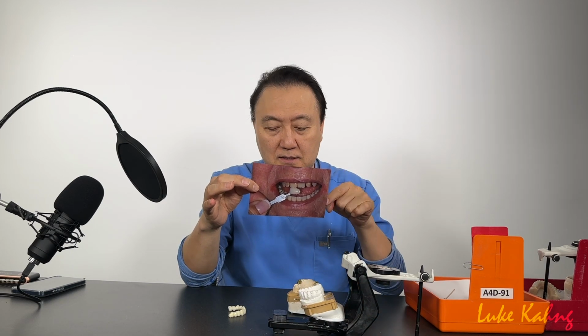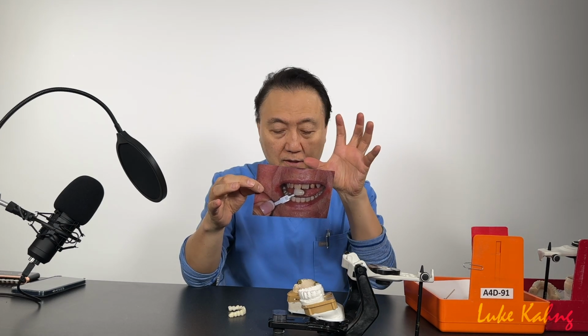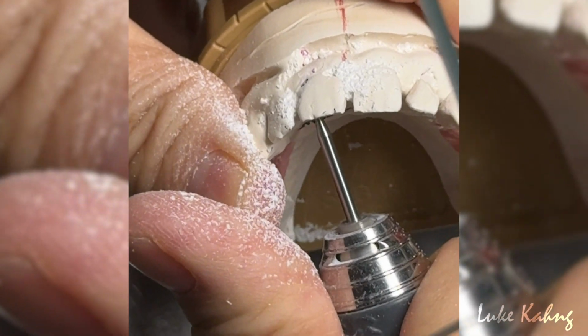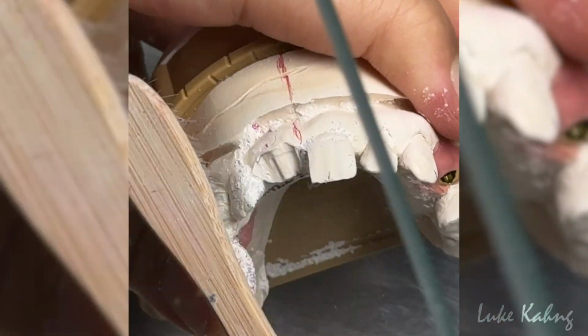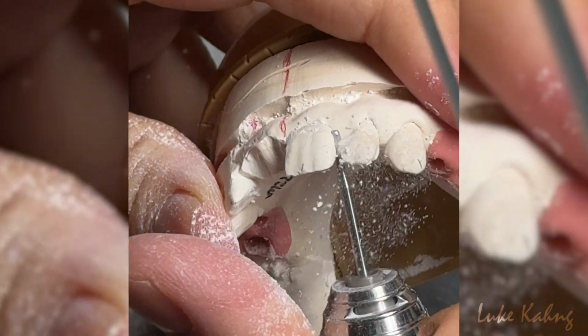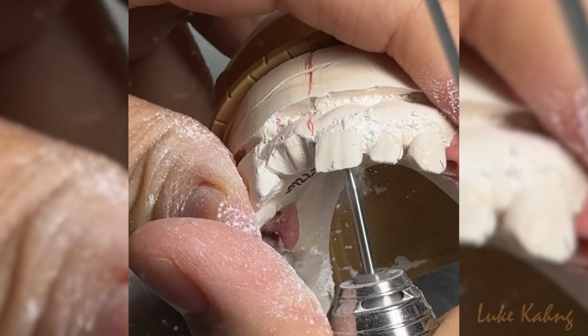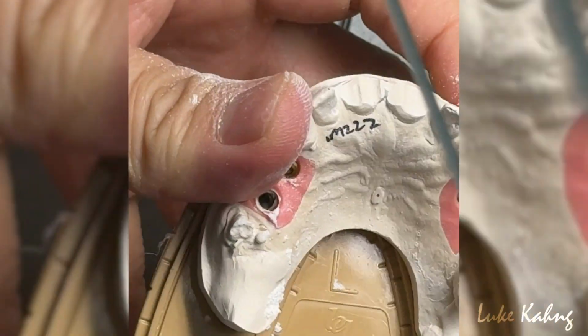In this case, it's pretty good tooth size and positioning, which is great. So as you can see in my video, I am grinding, I just pulled out the teeth and make the concave all the way to the bottom. It looks like I make the teeth look like gum here. Number one, we have to prepare the teeth before we go to full mouth restoration.